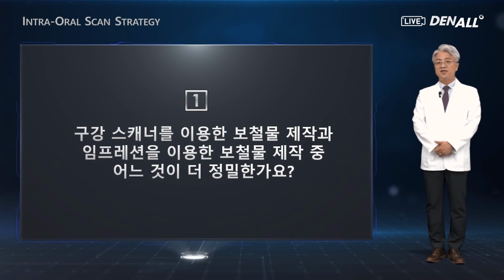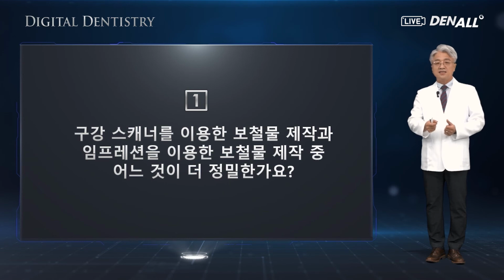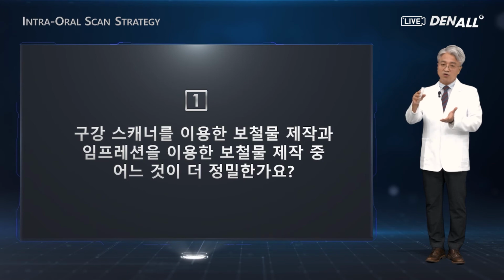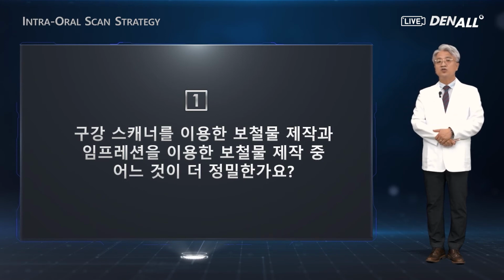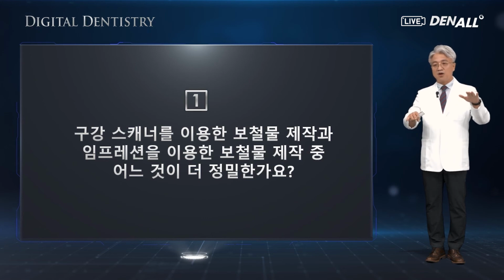First, the rubber impression taking or stone pouring has expansion and shrinkage errors, and depending on who works on the rubber impression taking, depending on the staff, the precision level would be different. There is a seasonal variance as well as errors in the model pin work. The mounting on an articulator also makes a lot of errors, so many errors. So in the modelless approach using an oral scanner, there is only one type of error associated with the oral scanner.